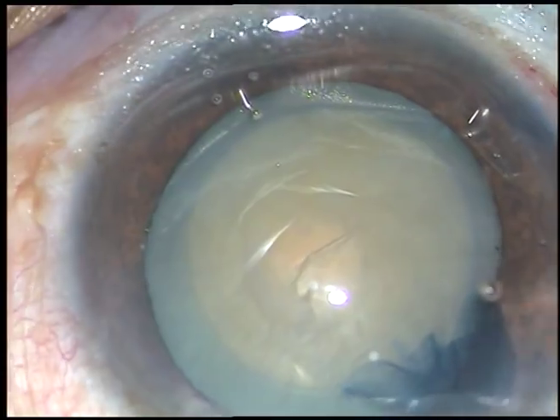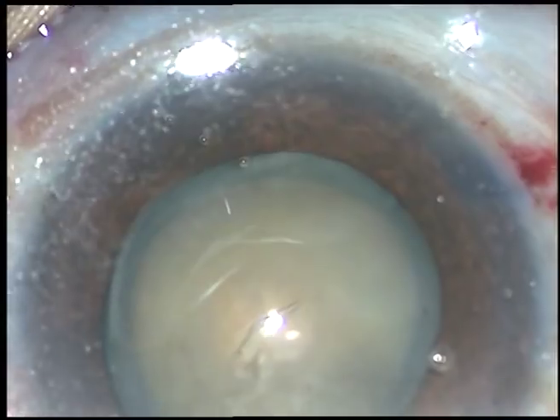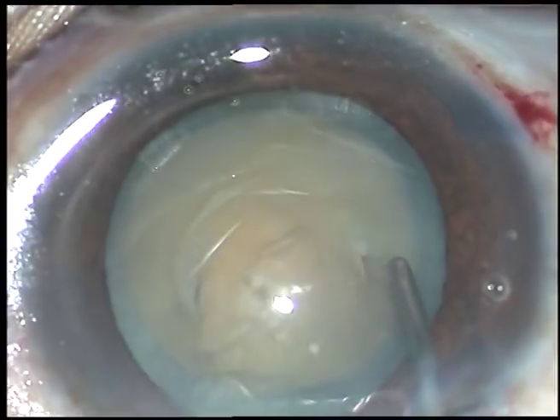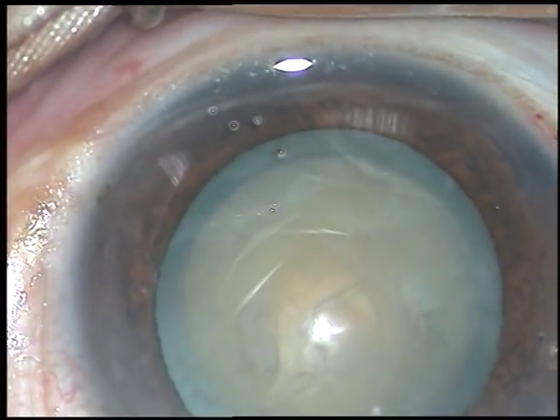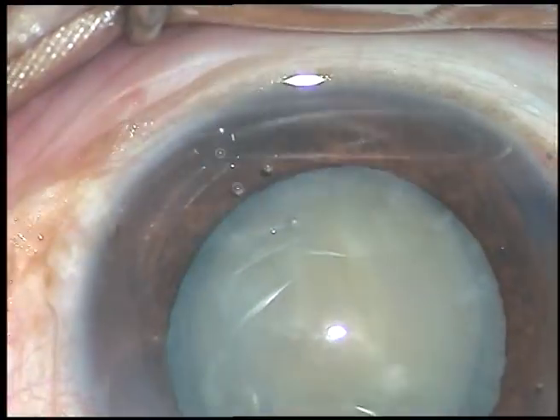Make sure that the pupil is dilated, it is round, and you get a round rhexis. The size of this rhexis is about 5.5 millimeters or so. Now this is hydrodissection — inject a little bit of fluid underneath the anterior capsular rim, tap the nucleus, and then rotate the nucleus.